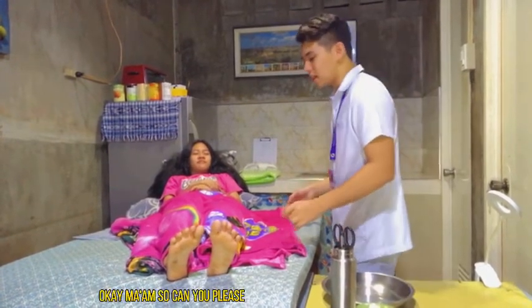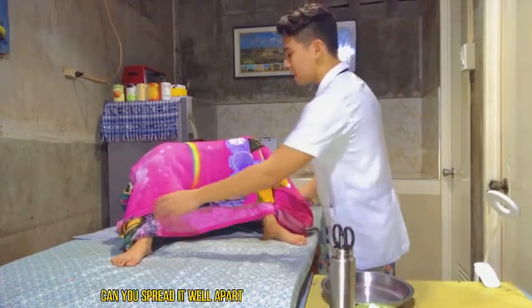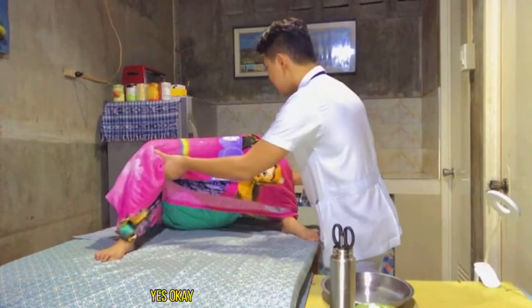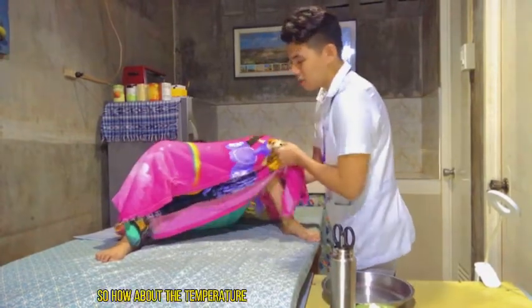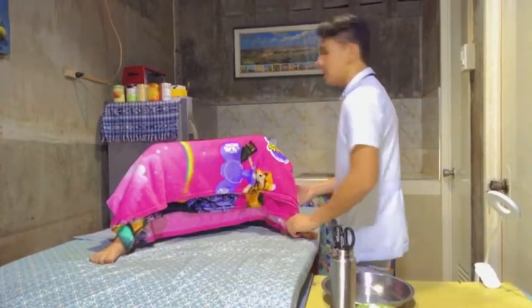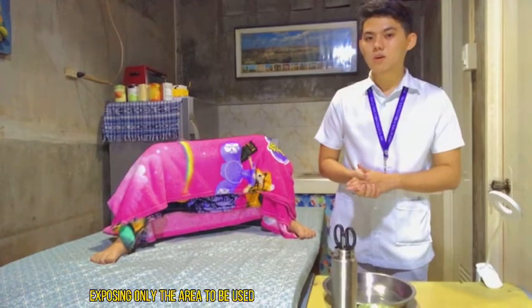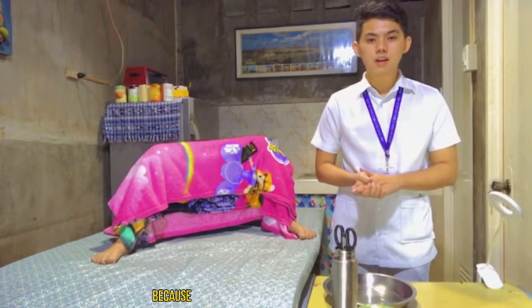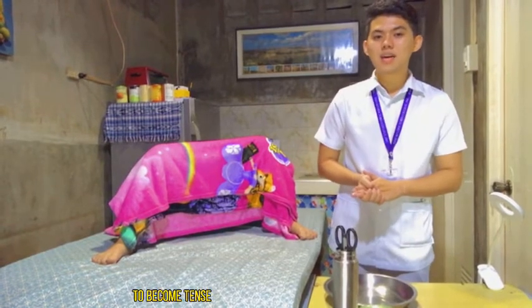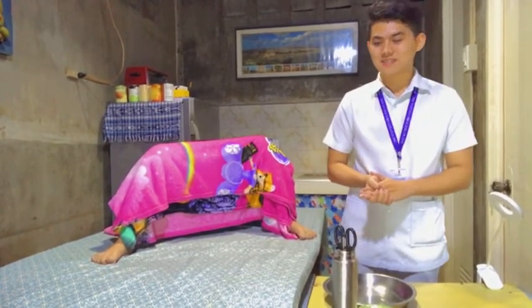Okay, ma'am, so can you please flex your knees for me? Can you spread it well apart, please? Are you comfortable with this position? Yes. Okay. So how about the temperature, ma'am? Are you okay? Yes. Okay. So, of course, we need to drape the patient, exposing only the area to be used, because embarrassment and chilliness will make the clients to become tense that can interfere with the introduction of the catheter.